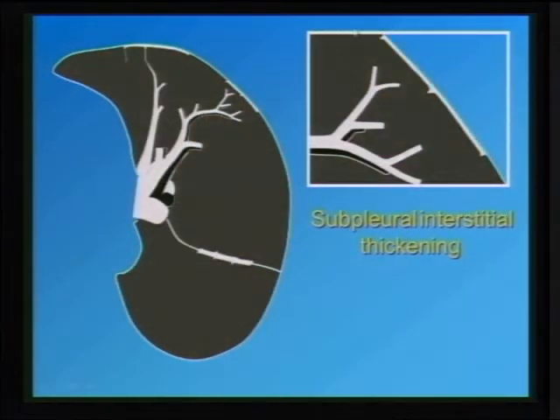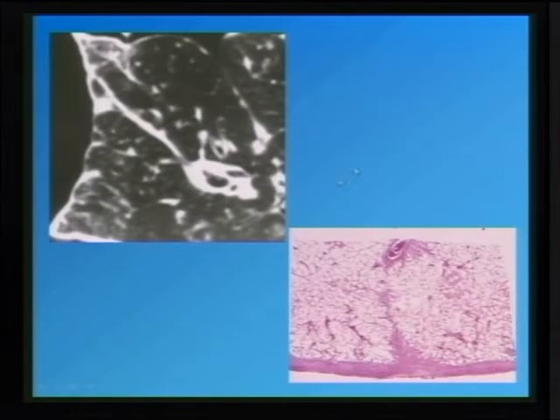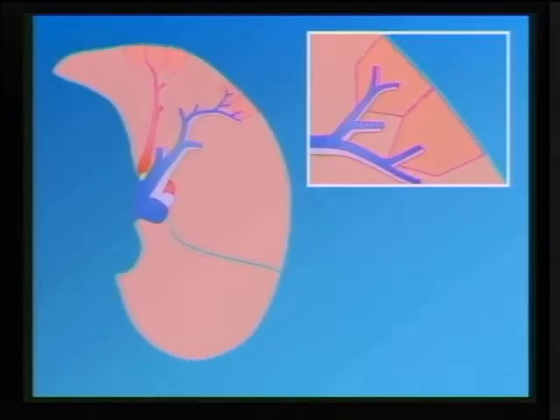And then remember that, obviously, below the visceral pleura you have the supporting connective tissue, and tumor can extend from the pleura into the supporting connective tissue, and it can extend into the connecting interlobular septa. That's what we have here, the example of tumor below the visceral pleura. This is all tumor due to mesothelioma, but you see how it goes into the interlobular septa. It basically just invaginates through the peripheral interstitium.